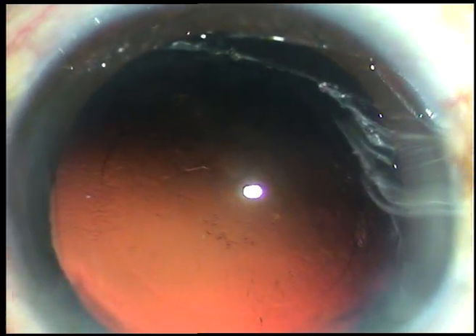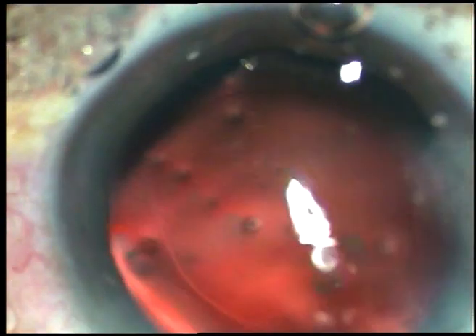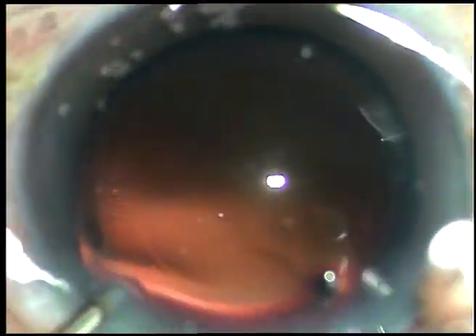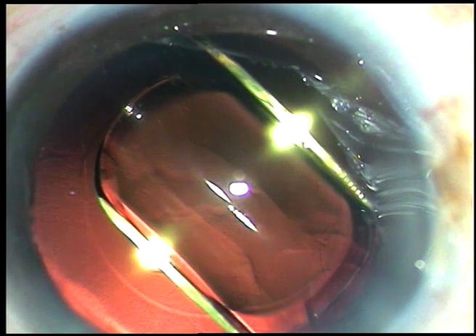Now, hydro polish — a jet of fluid is used to polish the posterior capsule. It works very well. This is the intraocular lens being implanted, keeping the anterior chamber formed by irrigation of BSS. The irrigating probe places the haptics of the intraocular lens in the capsular bag.